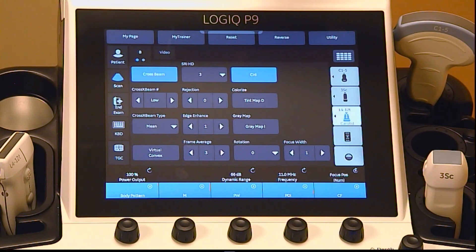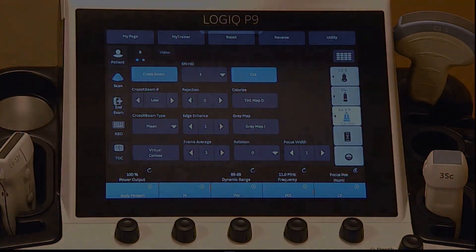Please refer to the Logic P9 Quick Card Guide or User Manual for additional parameter details.